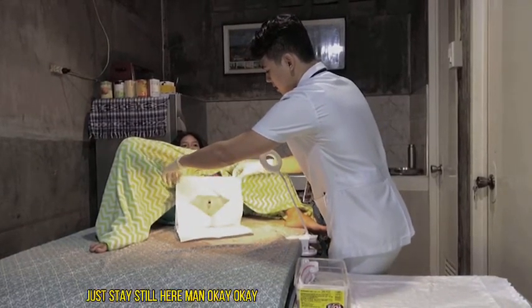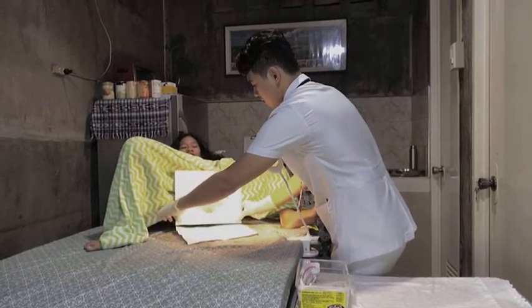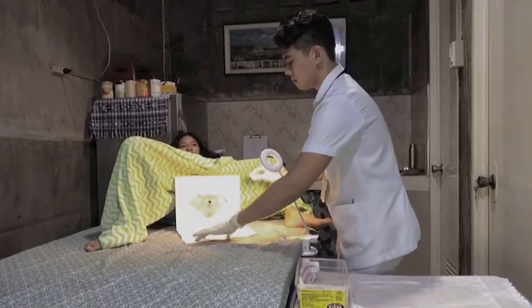Okay. Just stay still here, ma'am, okay? Stay still. Don't move, ma'am.